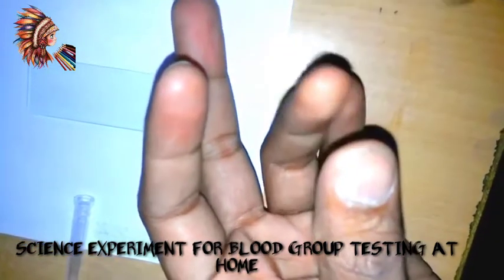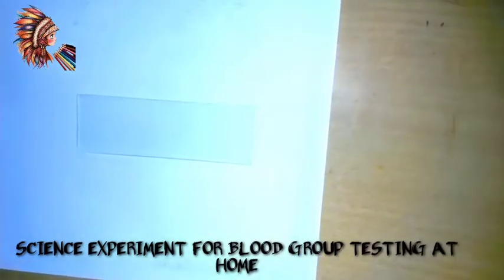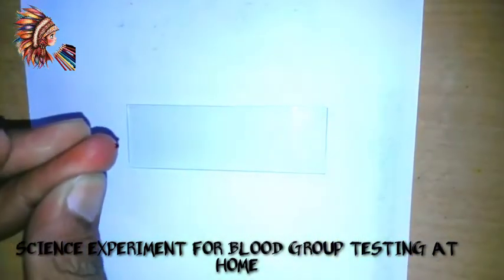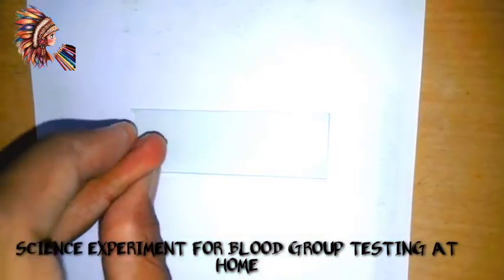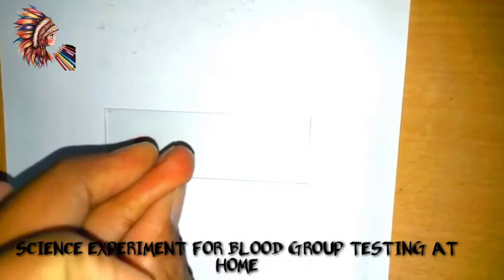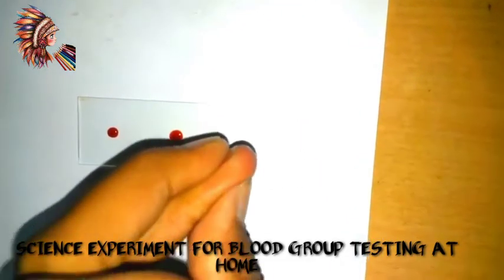I'm making a prick with the needle, and then three drops of blood are being placed on the slide like this. After that, we will put these monoclonal antibody solutions, since our body has antigens in it.